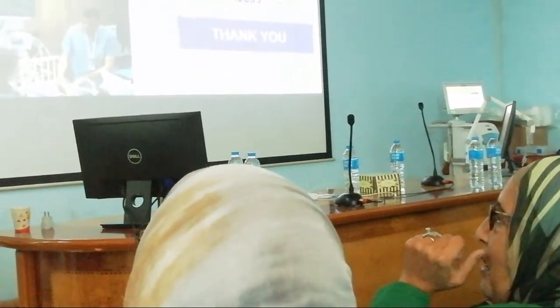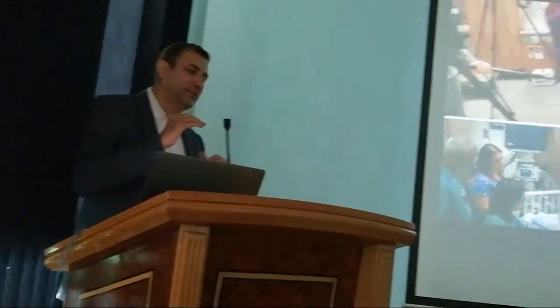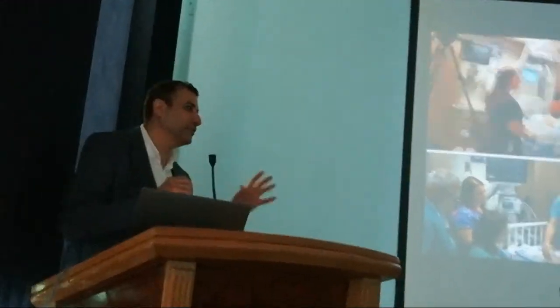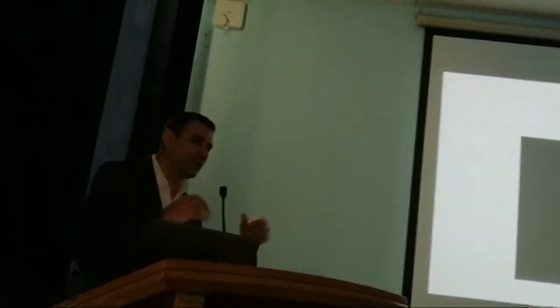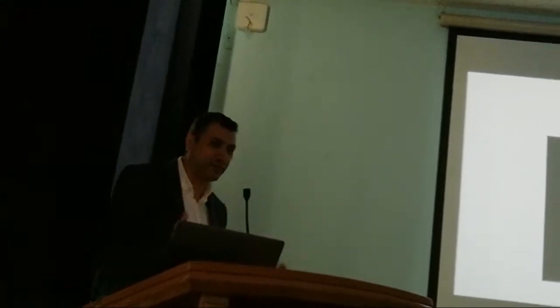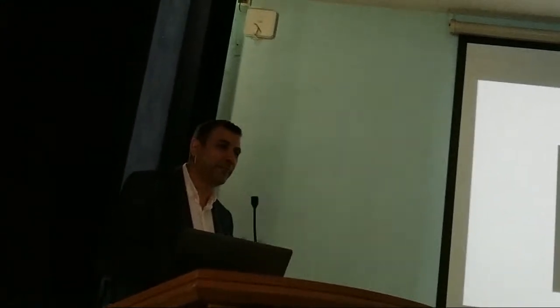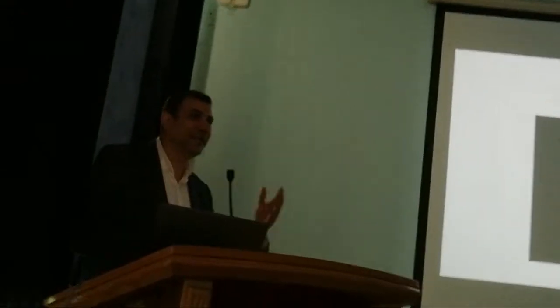So let me answer the concern that maybe Robin would like to answer as well. In a real scenario, when you recruit with such high peak, usually we do the high frequency. In this case, the issue is not really ventilation. The value of high frequency jet over the conventional is mainly for ventilation. For oxygenation, we need to recruit a lot. That you can do on conventional, up to whatever number of PEEP. Now with the new machines that we have for non-invasive ventilation, we can use even up to 20 non-invasive.